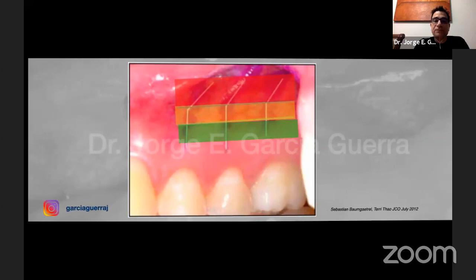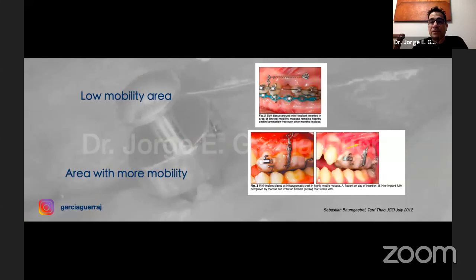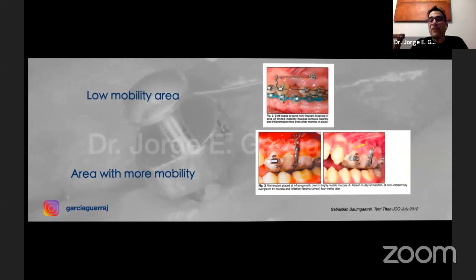Now, if we put it in a zone like we see in this picture, where we have a low mobility area, we're not going to have inflammation. But in the lower picture, which is from the article, if we put it more apically in the mobile tissue area, we're going to have a lot of inflammation there, and it's going to be very painful for our patient.